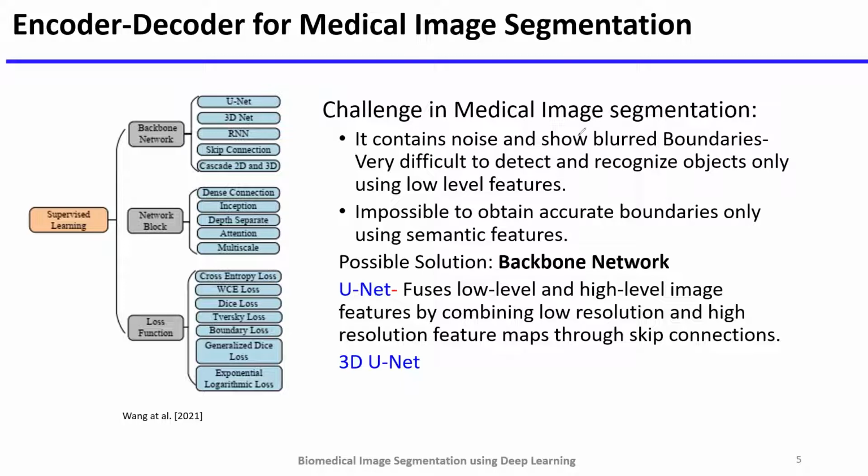But especially in image segmentation for medical images, many new cases, new diseases, develop in the body, so data sets are very, very small and boundaries are not clearly defined. So once we do the encoding part using the models, then using only low level features, it may not be able to perform better recognition and segmentation in the medical image domain.